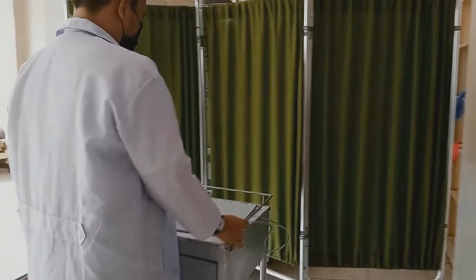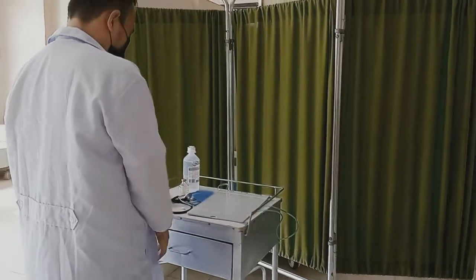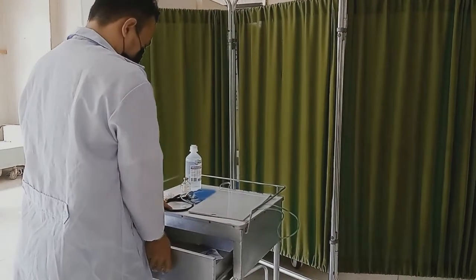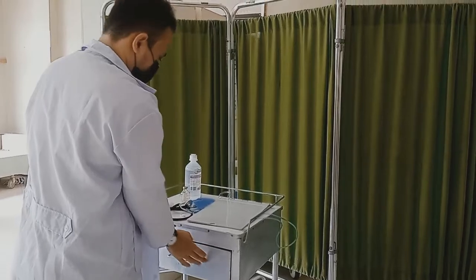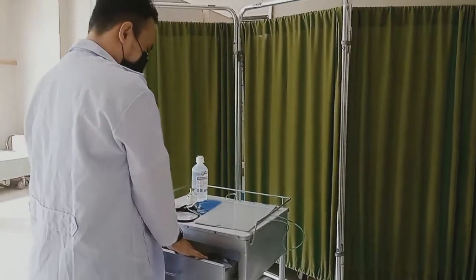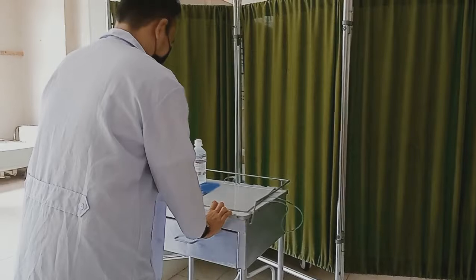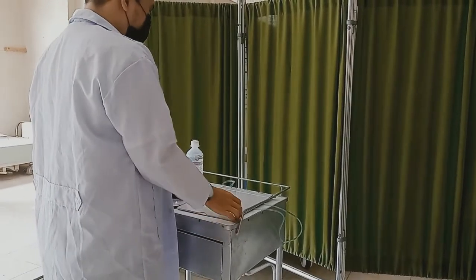Perform hand hygiene and move the medication cart to the outside of the patient room. Prepare the medication administration area. Unlock the medication cart or drawer, enter the passcode, and scan the employee identification if required. Prepare medication for one patient at a time.